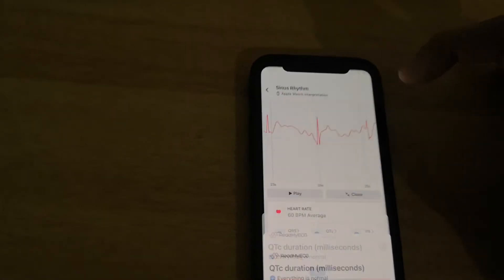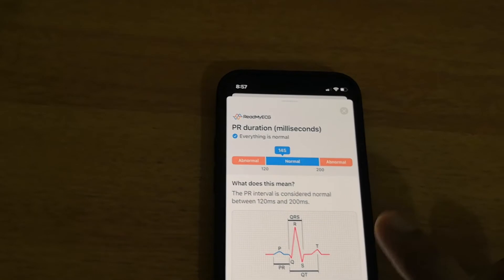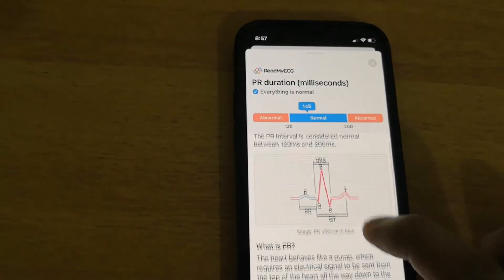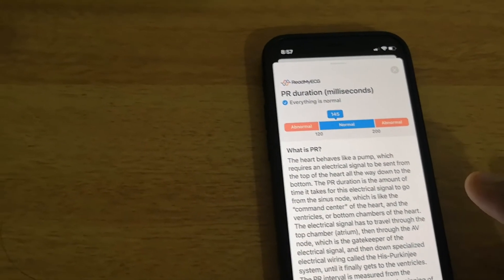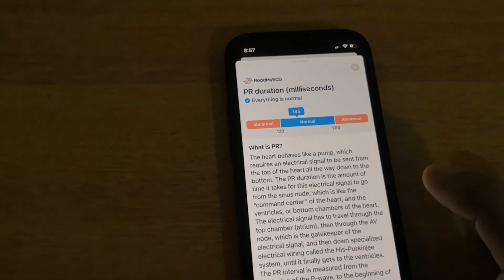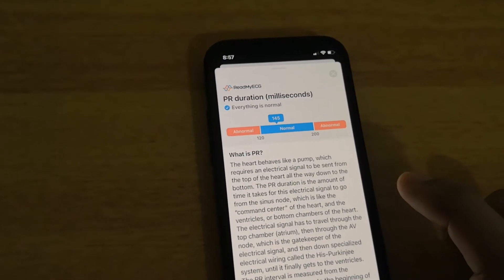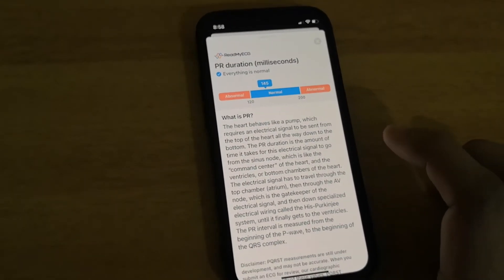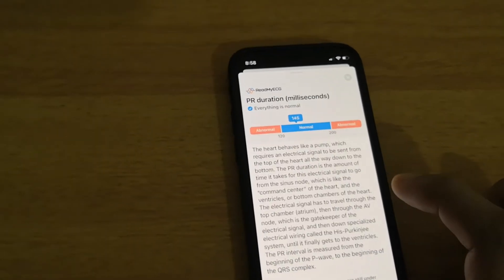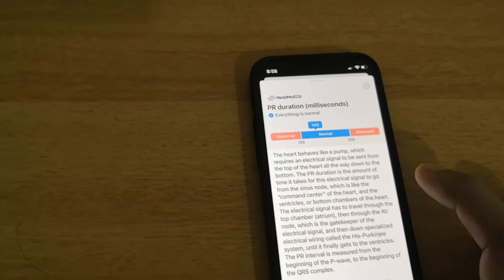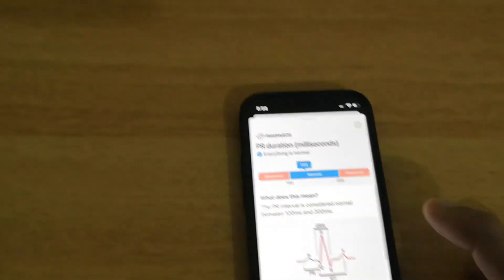If you come to PR, it shows the normal value from 120 to 200 milliseconds; mine is 145, so this is normal. The PR interval represents how long it takes for the electrical signal to go from the sinus node — the command center of the heart — down to the ventricles. The electrical signal travels through the top chamber, then through the AV node, which is the gatekeeper, and then down the specialized wiring called the His-Purkinje system until it reaches the ventricle. The PR interval is measured from the beginning of the P wave to the beginning of the QRS complex.